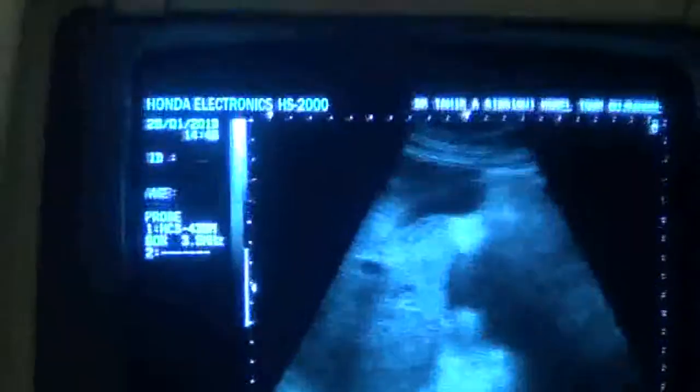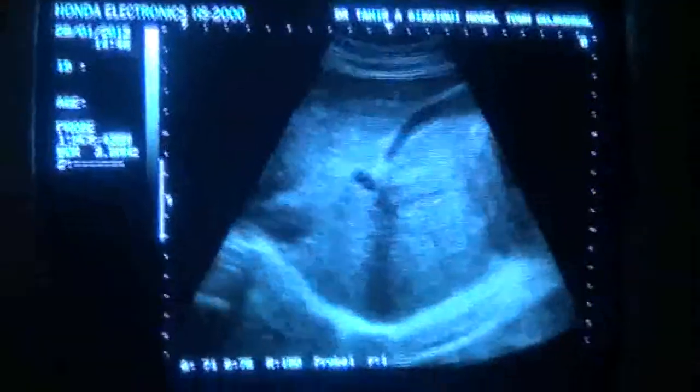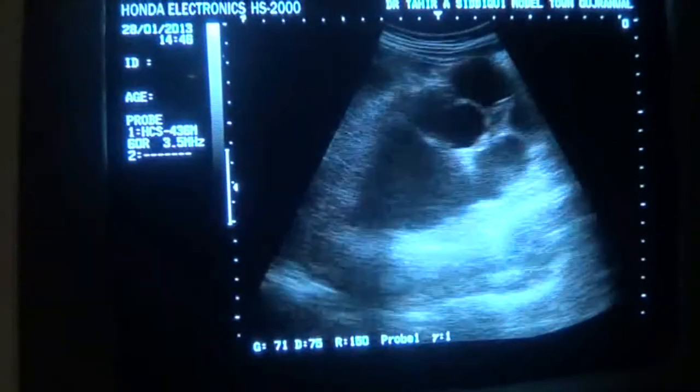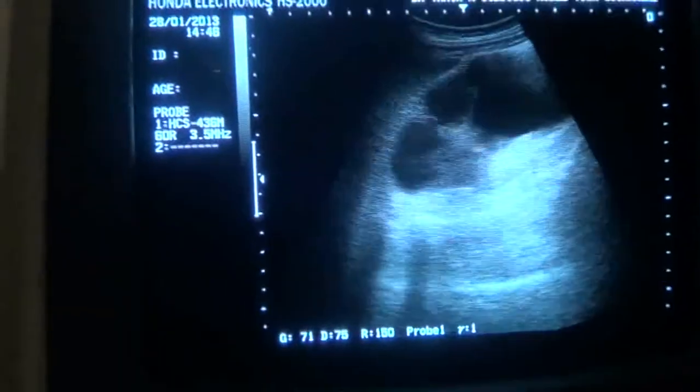She was catheterized. On ultrasound, she is a married female with 2 kids, normal, no cesarean section, no surgical procedures performed, and here we see the right kidney is dilated massively.